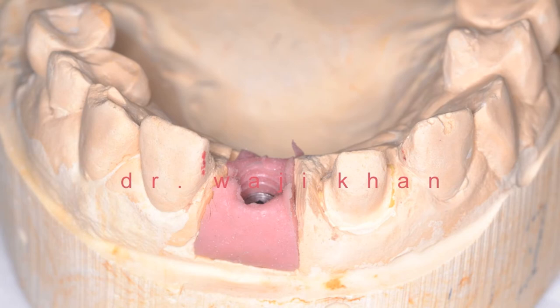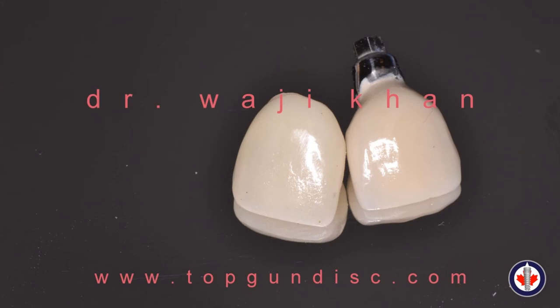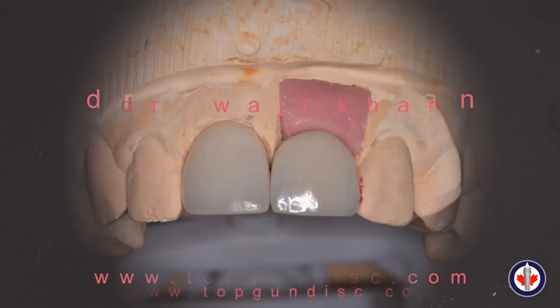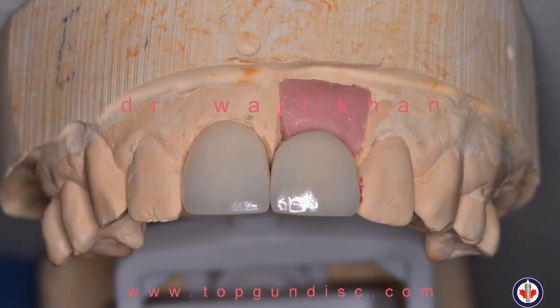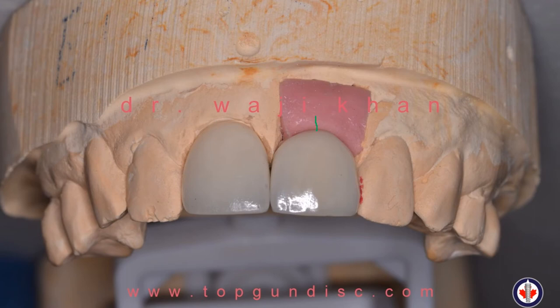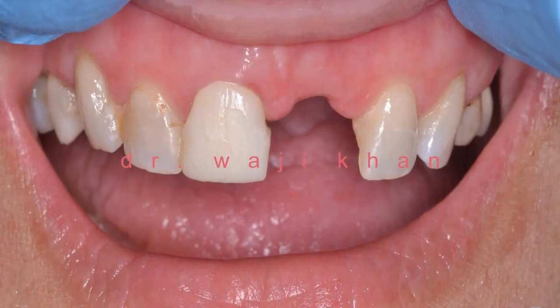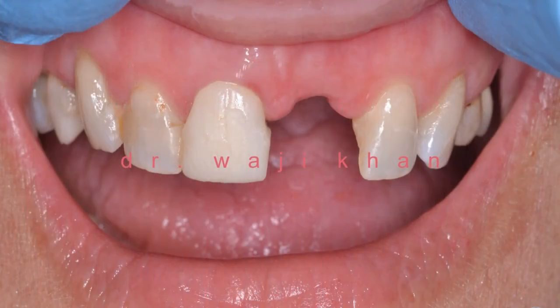Here's the pour-up of the lab model without prosthetics, and here are the actual prosthetics: an Emax crown and a UCLA screw-retained abutment for the central incisor. When we try these on the model we see a slight problem — I didn't communicate clearly enough to the lab about matching the gingival height of the implant crown to the contralateral central incisor, and that the implant had been placed apically enough to allow the crown to push down on the tissue for a proper emergence profile. This is where the Photoshop trick comes in.